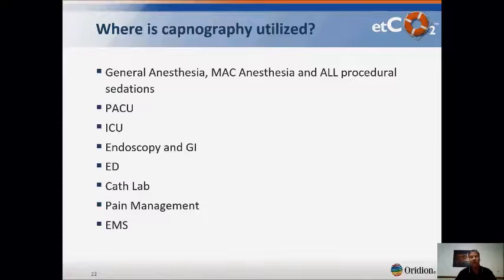Pain management has become a big area for monitoring. You might have a patient with the buttons they press to give themselves more pain medicine, and when they press those, sometimes they can get over-sedated. So on the basic patient floors, if they're under an opiate or some kind of patient-controlled anesthesia, a PCA pump, they are often monitored with CO2 monitoring because they're not monitored in other ways, and there's not a nurse present like there would be in the PACU or in an ICU, and you can have a patient stop breathing and end up in serious condition.